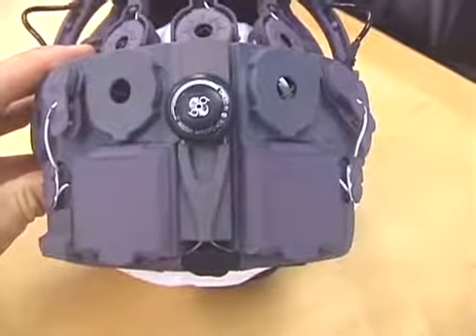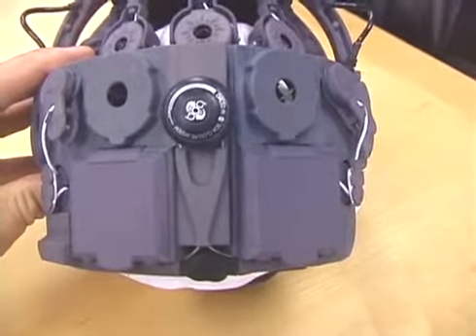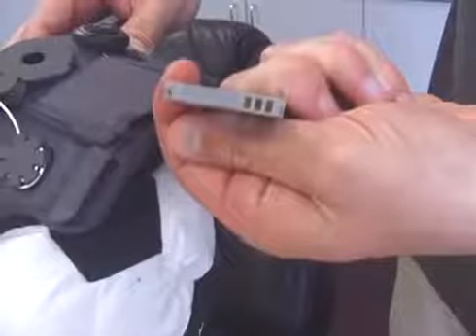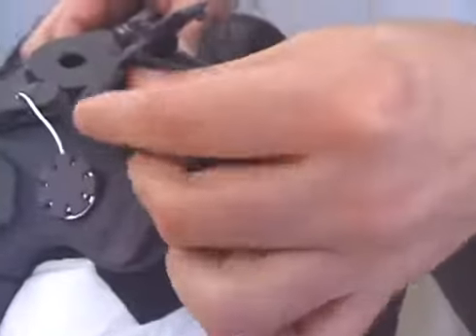When you remove the headset from the case, you will see the two battery compartments on the back of the headset. When inserting the battery, locate the contacts in the battery compartment and make sure they line up with the contacts on the battery. Insert the battery and close the lid.